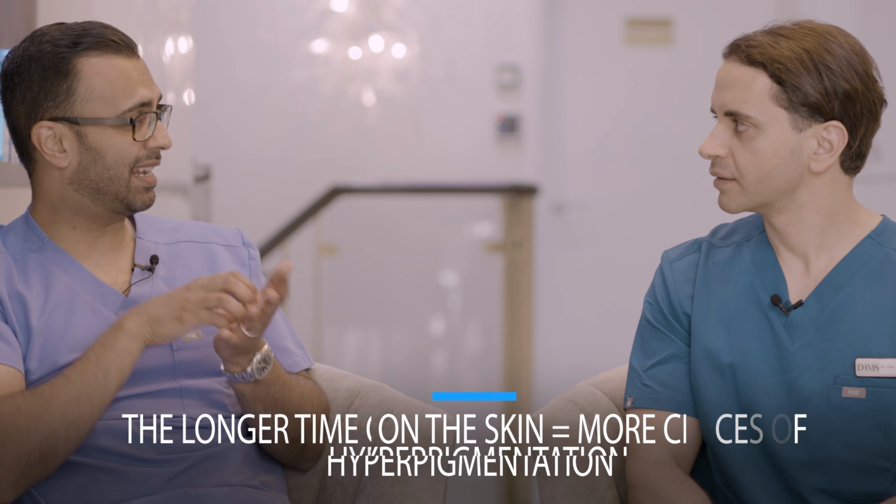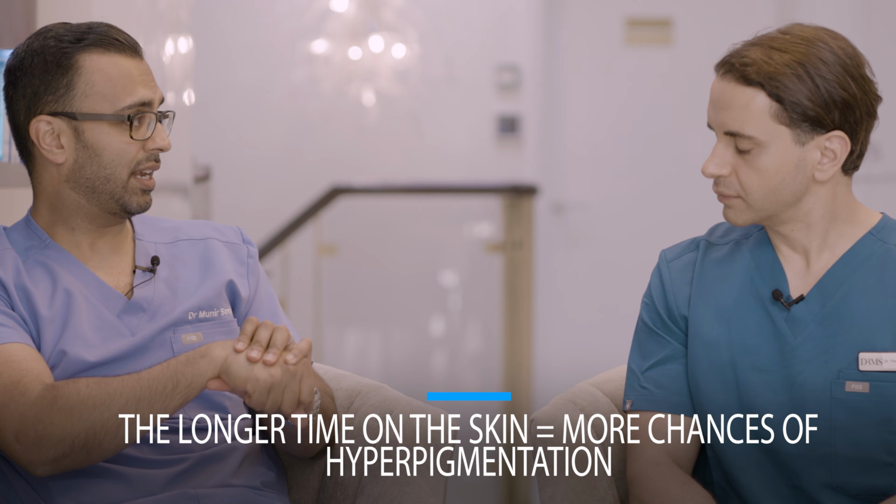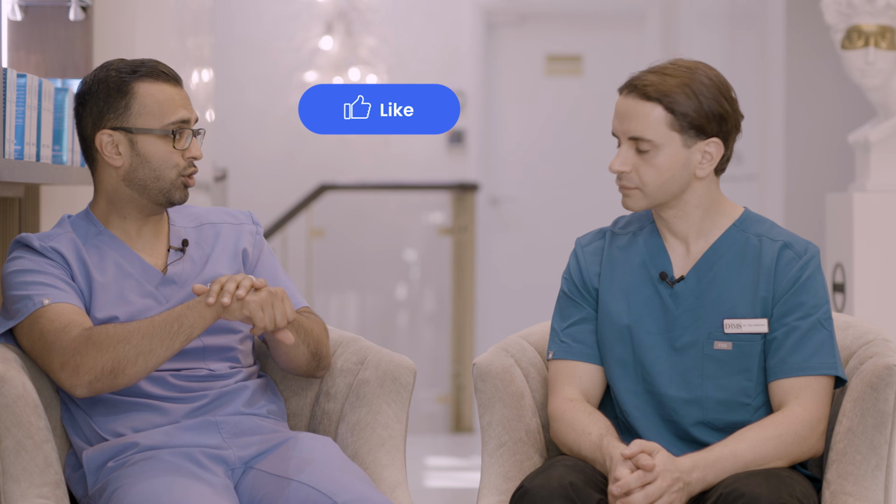because there's always going to be a large cohort of patients that really don't recover so well. How long the laser stays on the skin matters: in darker skin types, the longer you stay on, the more chance of hyperpigmentation. So if you've got someone with my skin type, you might have high power but shorter dwell time, and you might do a couple of passes with the pixelations a little bit closer so that you still get good energy. Someone like you might be able to get away with double pulse or a longer dwell time on the skin. So you can lower the power but increase the dwell time, and the aggressiveness of the treatment could be a lot higher.